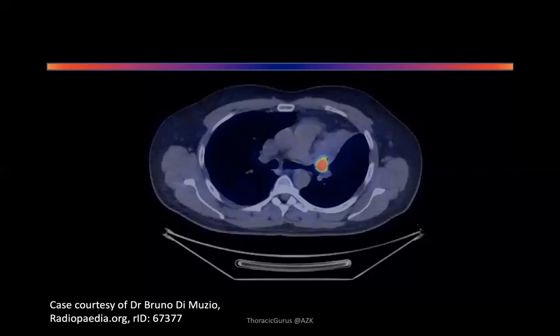This is a PET CT. Very good. It's showing a lesion on the left side of the hemithorax near the left bronchus. Which bronchus? On the left. Left main bronchus. Upper lobe. Actually, it's the upper lobe bronchus. You're right, left upper, but it's coming into the left main as well. Okay, what else? Quickly.